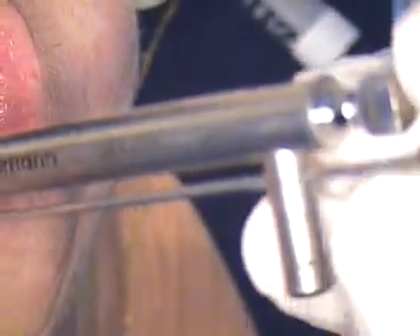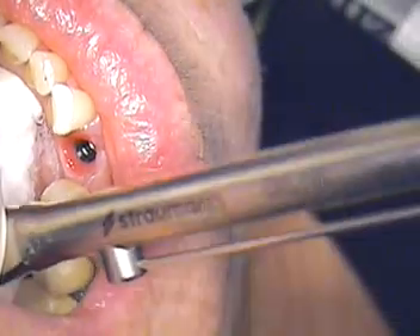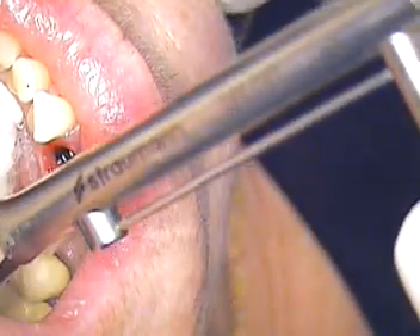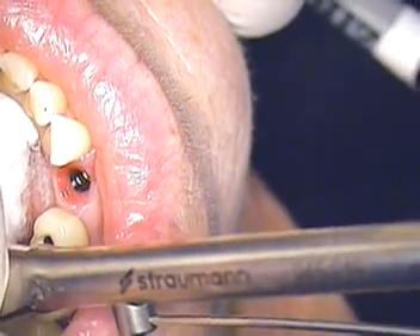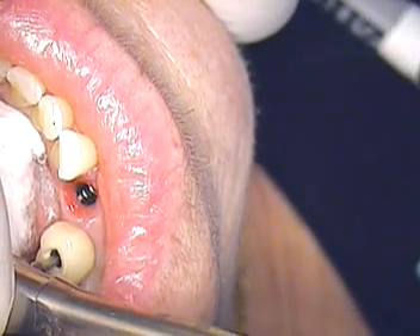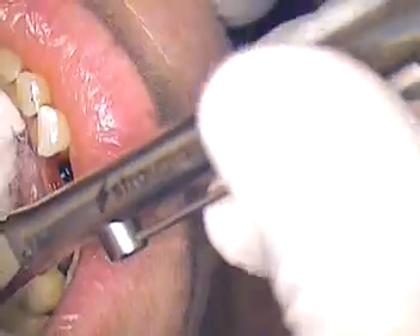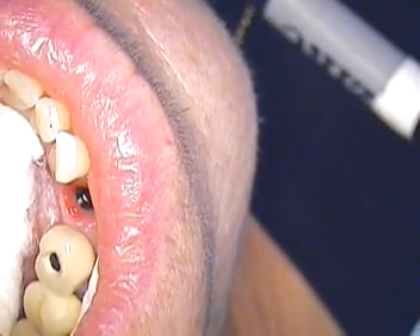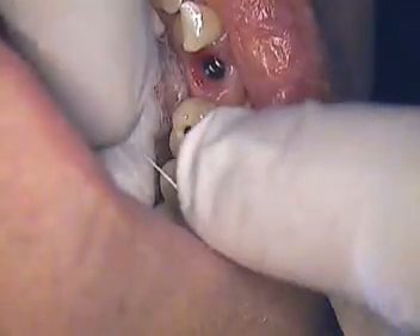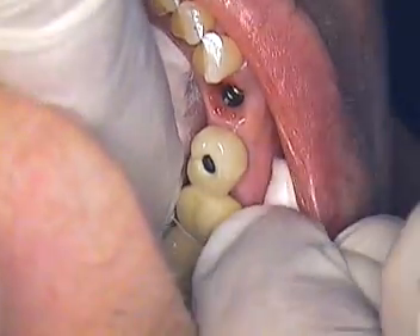Wrenches in place. I'm going to go ahead and start to tighten now. Are we doing okay? I'm just going to take that right up to 35 newtons. We are going to check the contact — I'm at 35 newtons right now. We're going to send our floss through again. In it goes. We're checking the back tooth as well — that's still a little tight, but we're through.